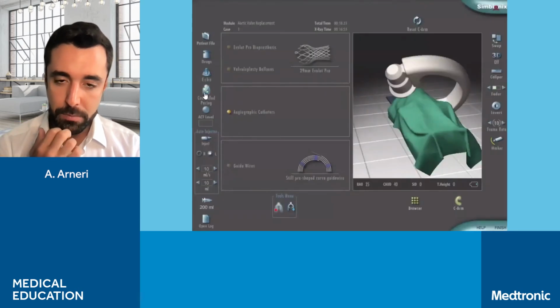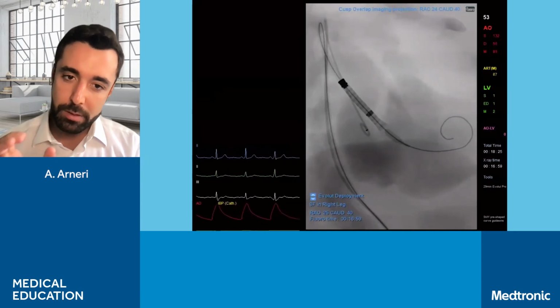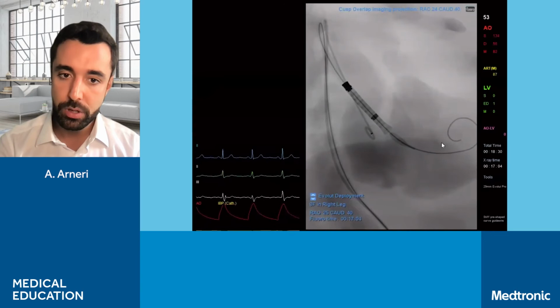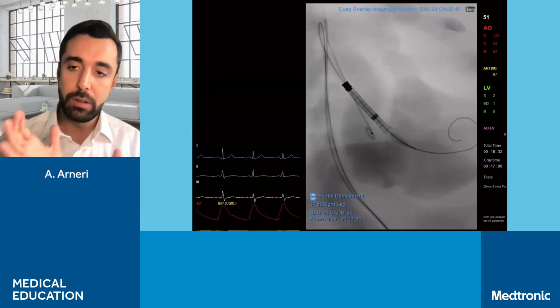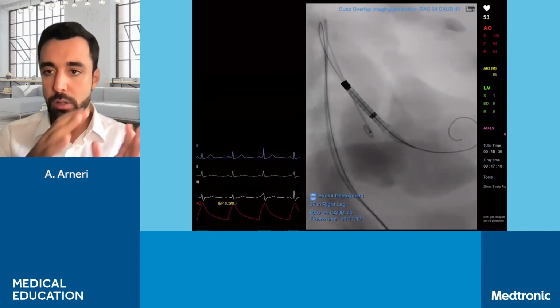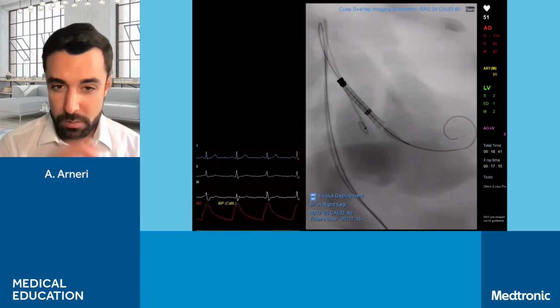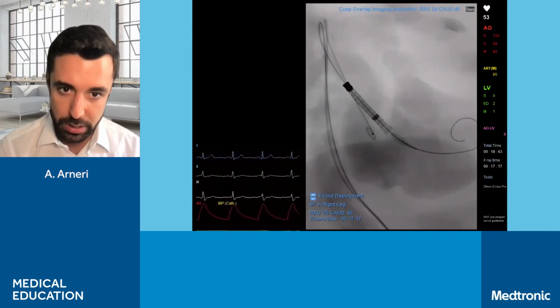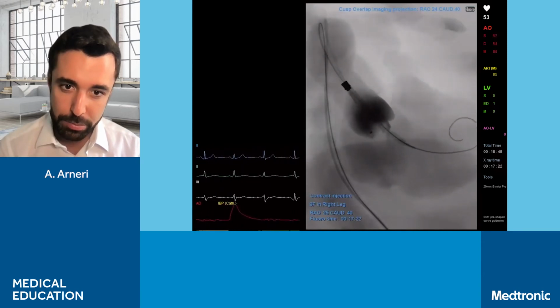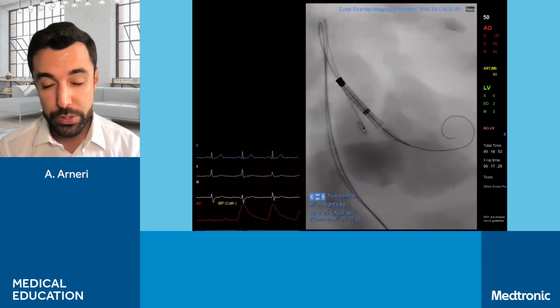Maybe we can, sorry, George, to show another tip. If we want the valve a bit higher, what we can do is pushing on the guide wire, which is in the ventricle. By pushing on the guide wire, the valve will go a bit higher, in a high position. If you pull back with the wire, the valve will go a bit more down in the ventricle. We can do a small contrast injection here to see our implant depth. So we see that now we are a bit higher. It's a bit less than 3 millimeters, probably 1 or 2.